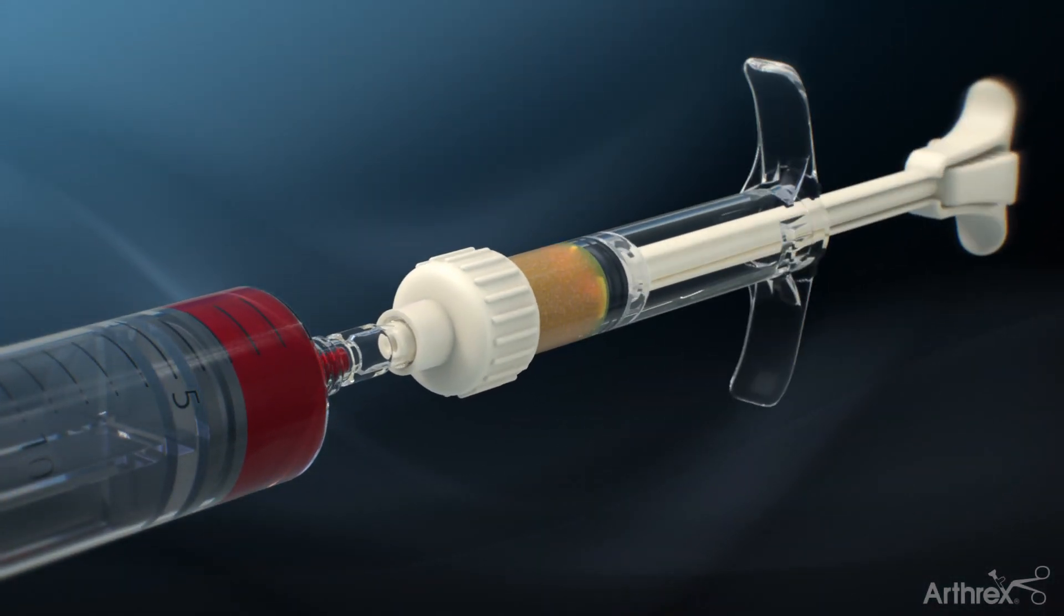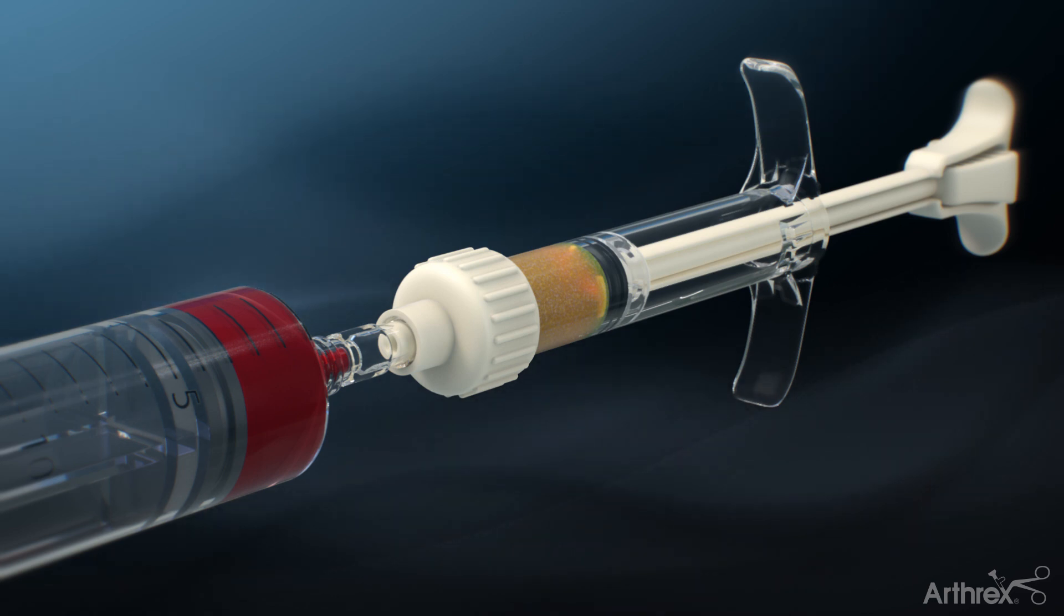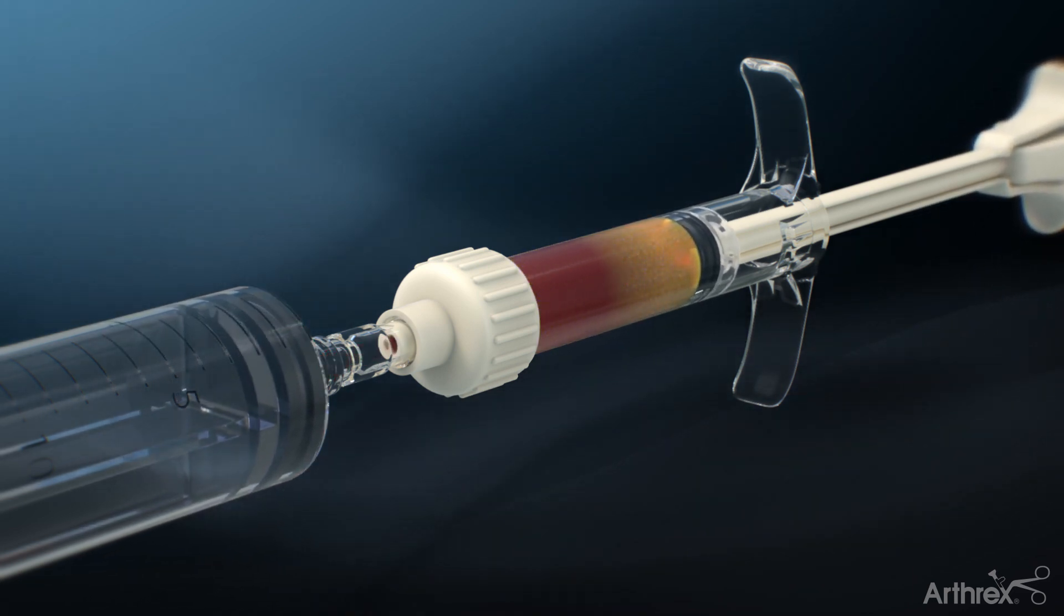The BMA is transferred to the mixing and delivery syringe filled with AlloSync Pure using a female to female luer adapter.